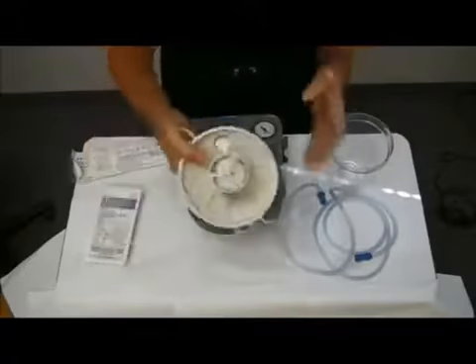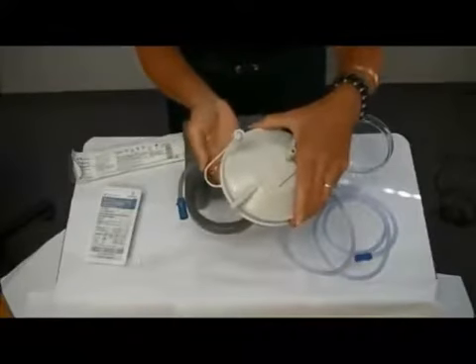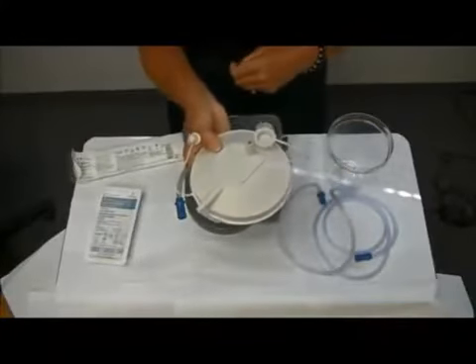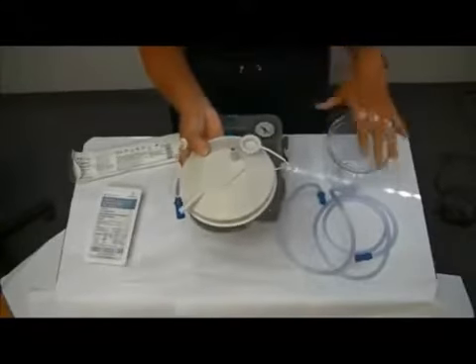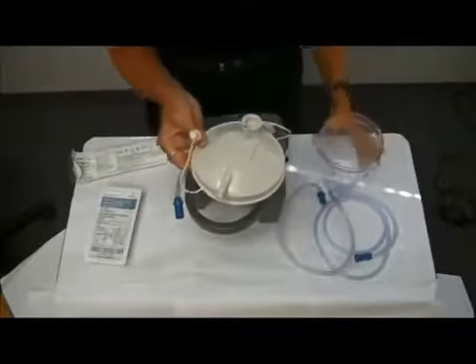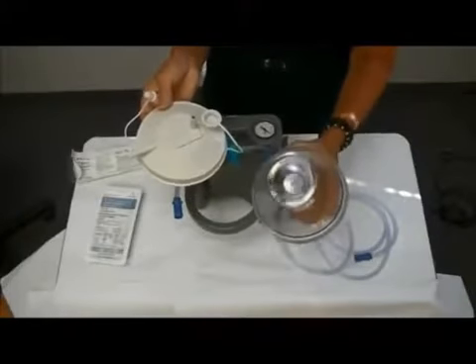If you look at the top of the lid, there's a float inside — that's a safety mechanism. If you overfill your canister and the float gets wet, it will pop up to the top and you won't get any suction. So if you're not getting suction, check that your jar hasn't gotten too full and that the float on top has not gotten wet. You can wash your canister with mild soapy water, and if you're using your suction machine every day, you should be cleaning it every day.